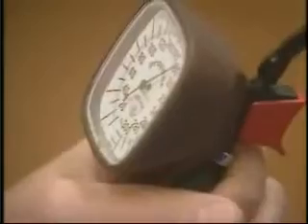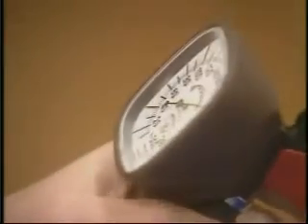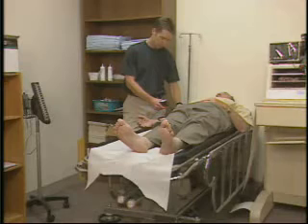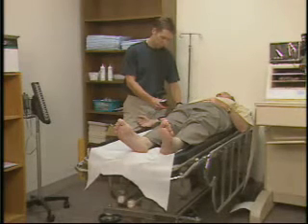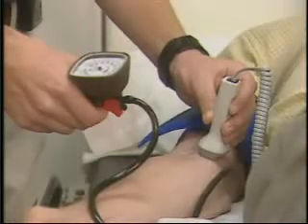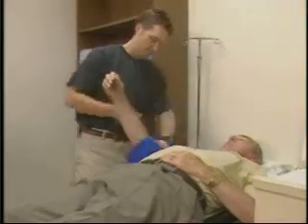Inflate the cuff approximately 20 millimeters above the point where the sounds disappear, and then slowly, about 2 millimeters per second, deflate the cuff until the sounds reappear. Record this pressure and deflate the cuff to 0. Now repeat the process for the other arm.